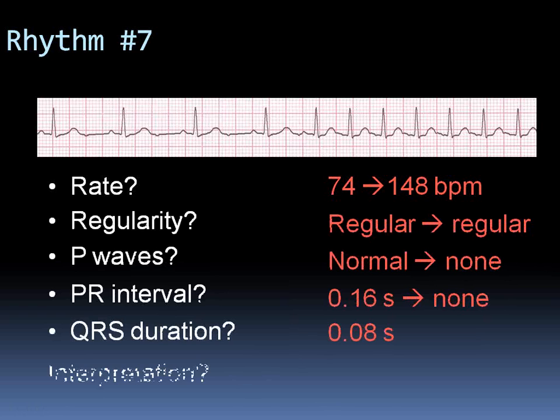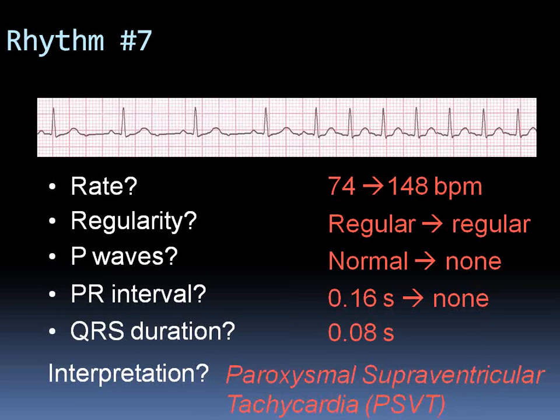All right. So this was just some basic EKGs about SVTs, AFib, heart blocks, and atrial flutter. Now what I want you guys to do is just pick up any simple ECG book, okay, and just go over some reading from that too.